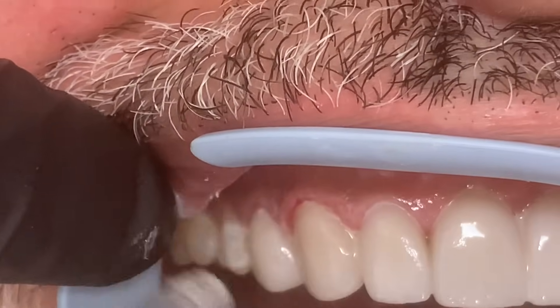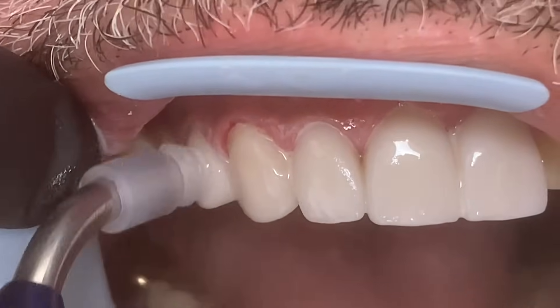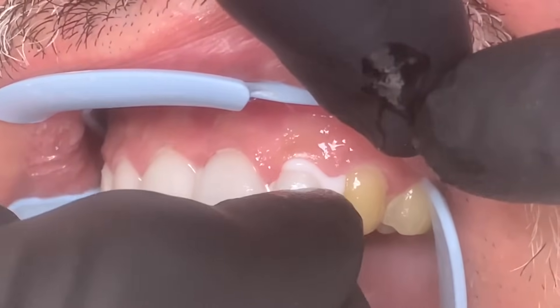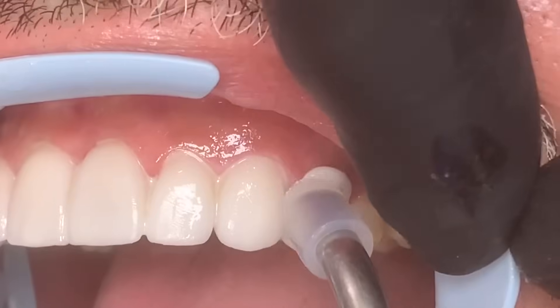This is the last one on this side. Sometimes you have to use your fingers to place it — there we go — and then we'll tack it down. So we've seated them all, and now each tooth is individually zapped with an ultraviolet light that actually sets the material. That creates the strongest bond, and we'll show you the results in a minute.